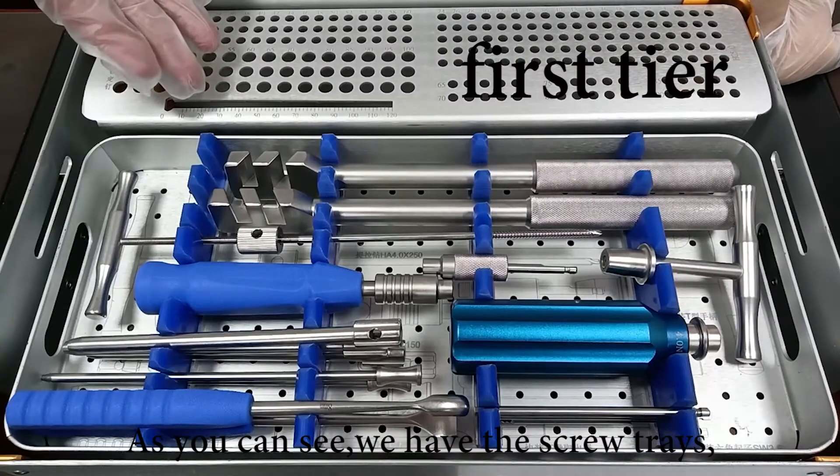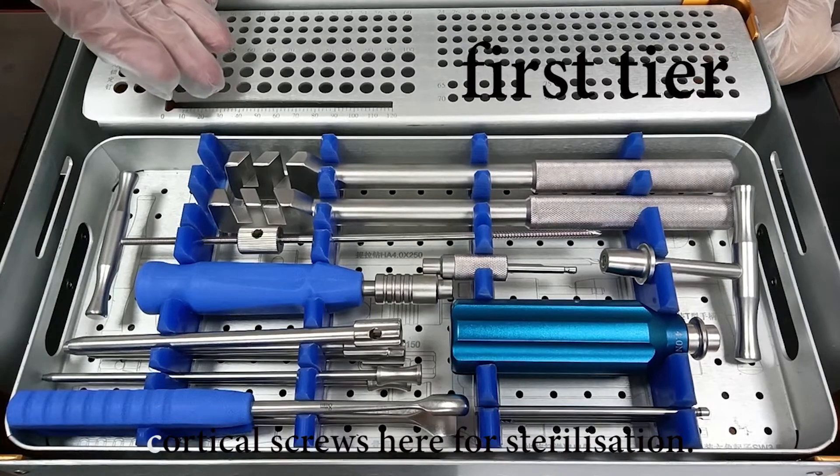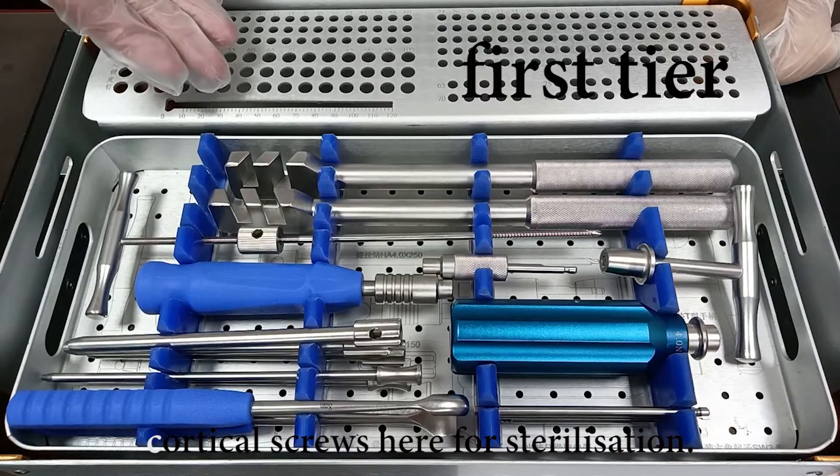As you can see, we have the screw trays. You can put the locking screws and cortical screws here for sterilization.